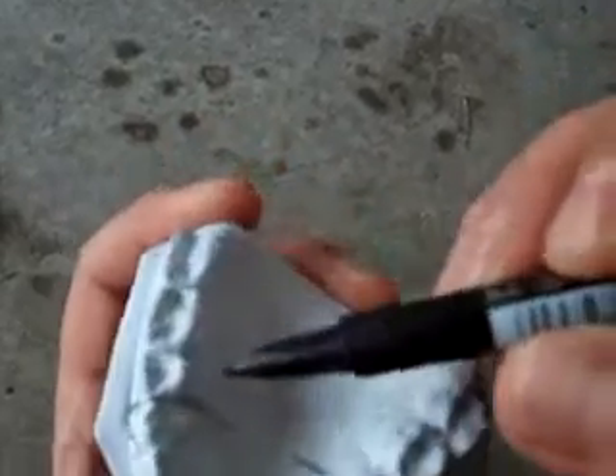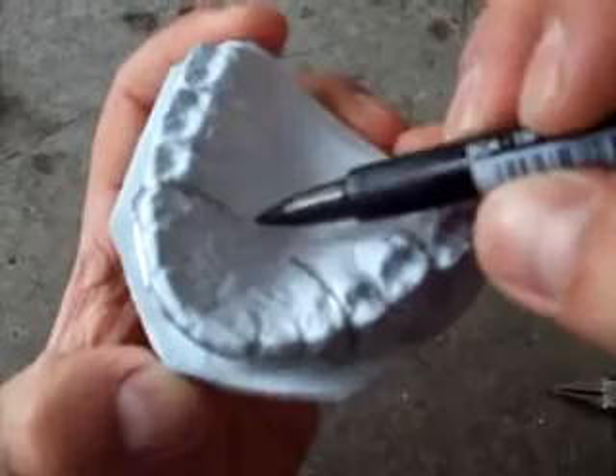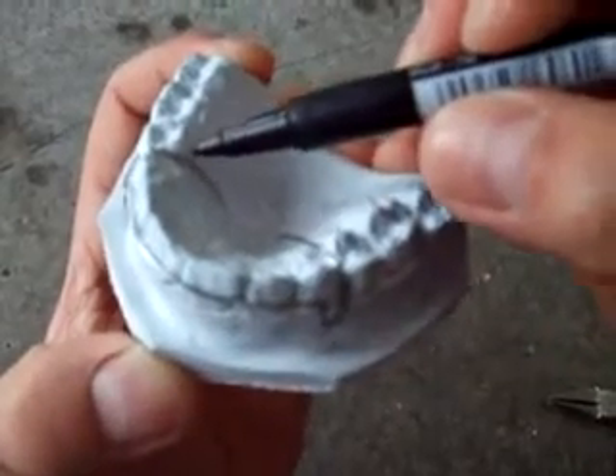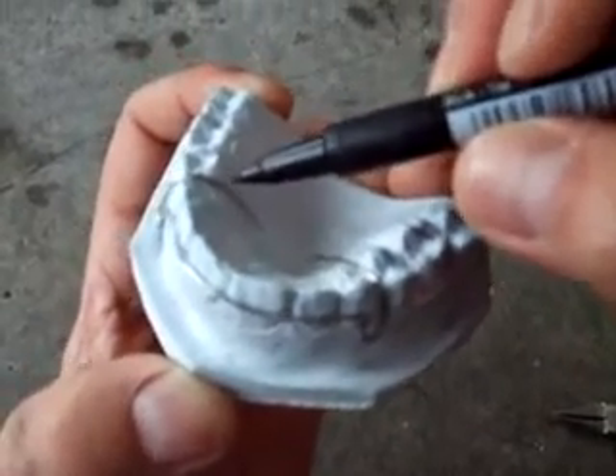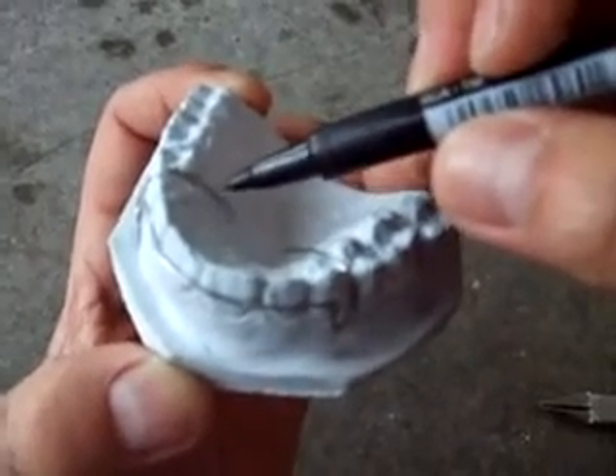Now the crossover passes through the canine to the palatal belt like this. We have to remember to leave a brief space beneath the wire to be filled with acrylic.